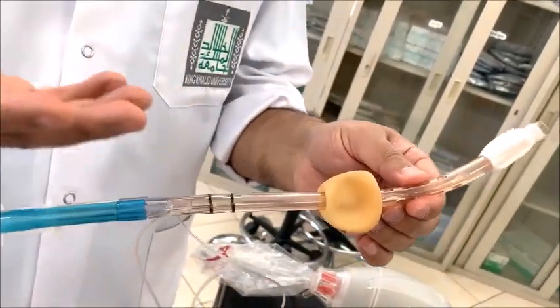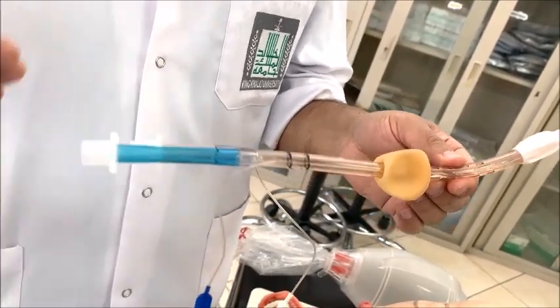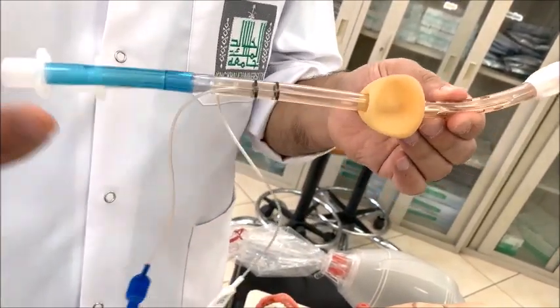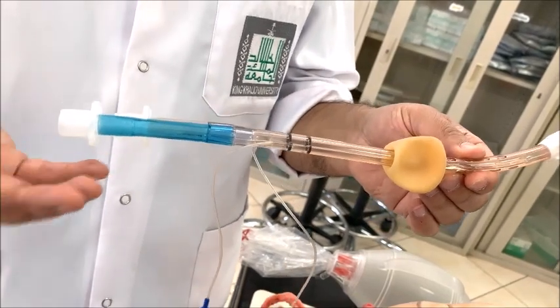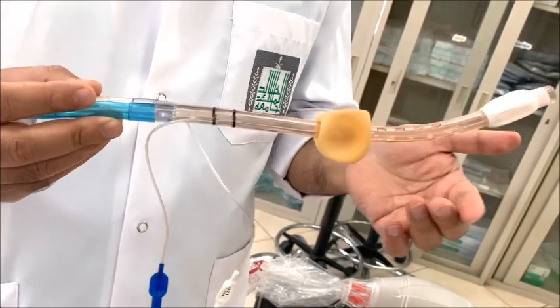Where can we use it? It can be used in emergency situations, if a person is not expert in advanced airway management, or if there is a difficult airway situation. In those cases, you can use this Combitube.